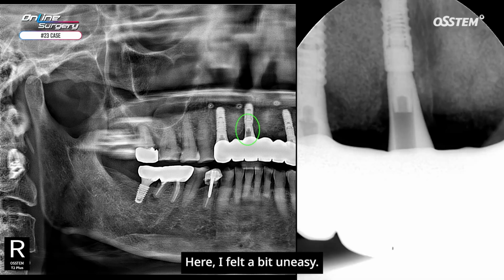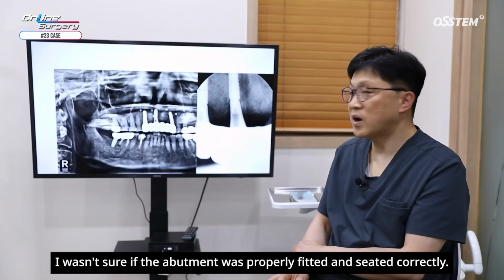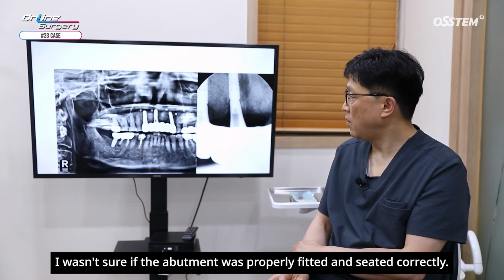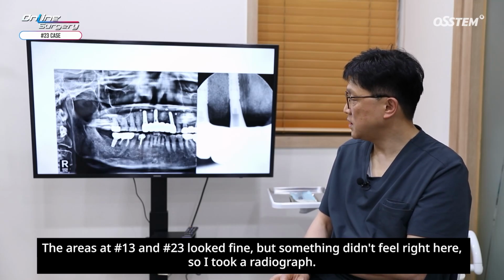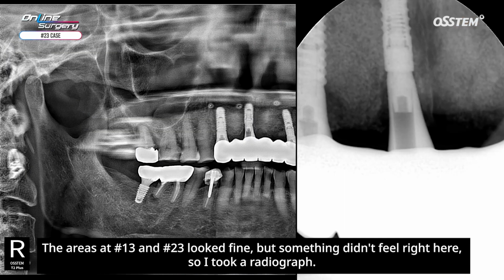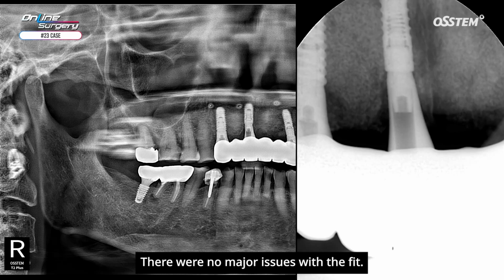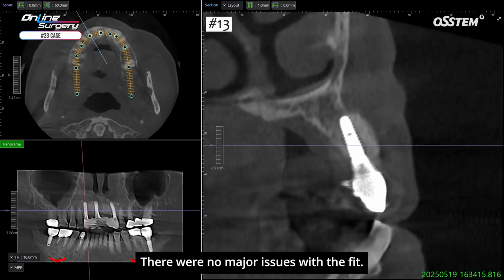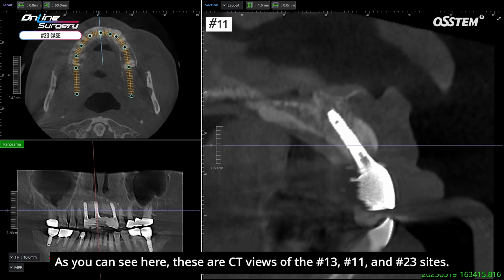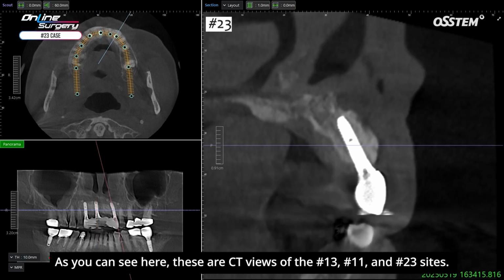Here, I felt a bit uneasy. I wasn't sure if the abutment was properly fitted and seated correctly. The areas at number 13 and number 23 looked fine, but something didn't feel right here, so I took a radiograph. There were no major issues with the fit. As you can see here, these are CT views of the number 13, 11, and 23 sites.